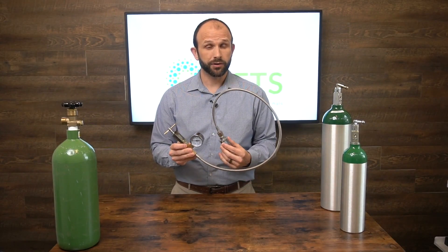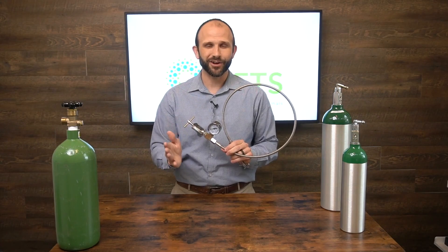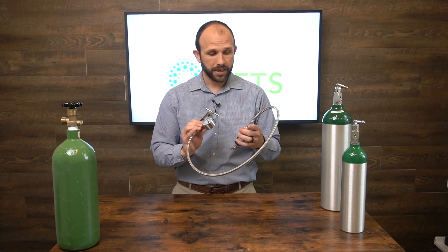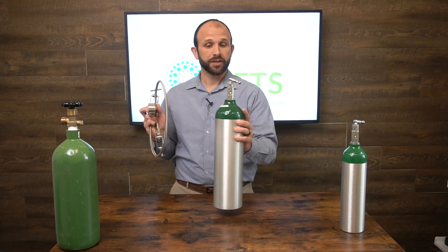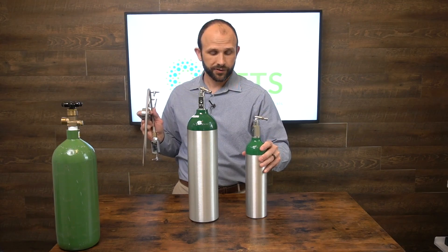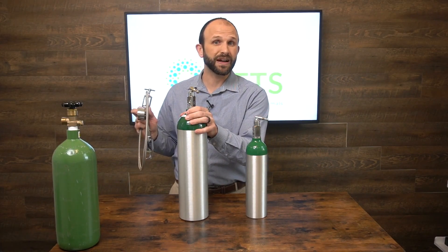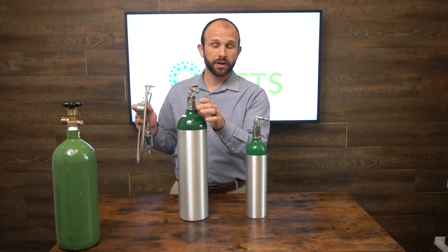This is called a transfill hose — it transfers oxygen from one tank to the other. The thing about this hose is it doesn't matter which tank is smaller or larger; the oxygen will flow from the tank that has the higher pressure. So if this tank has 1000 PSI and this tank only has 500 PSI, it will fill from the smaller to the larger.